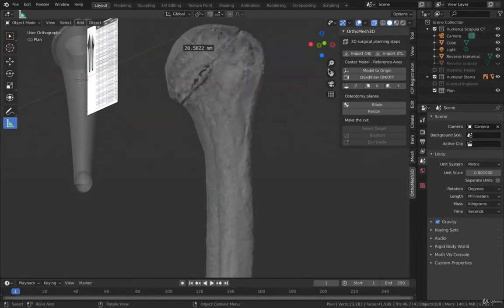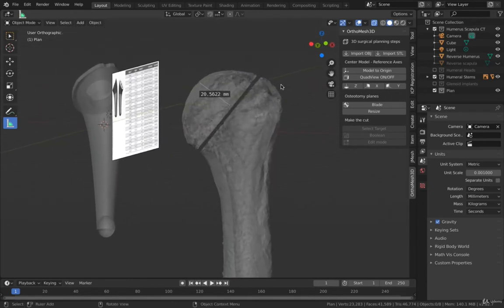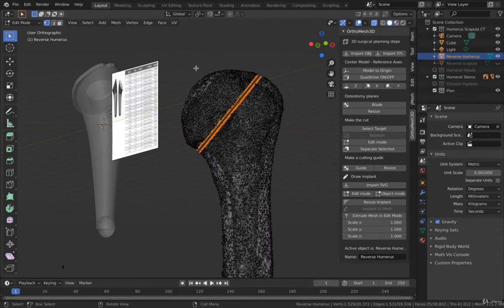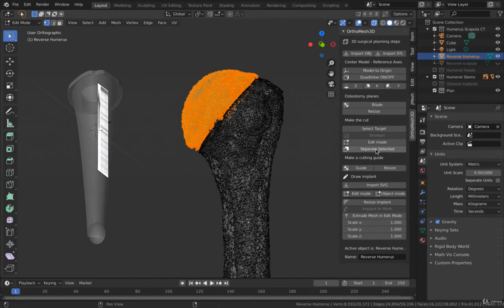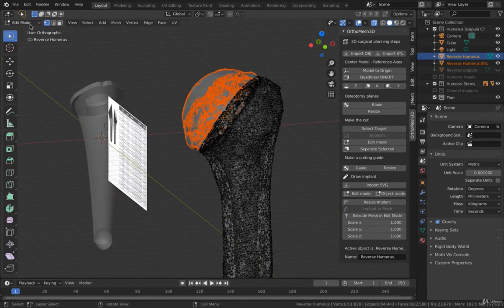pretty good. So I'm going to move this down, and then I'm going to go to edit mode by pressing the tab key on the keyboard. And now I'm in edit mode, and then I'm going to select my lasso, and I'm going to go into this line carefully, select all of this, and now have selected the head that I need to resect, and then I'm going to go separate selected, and that's now a new object.